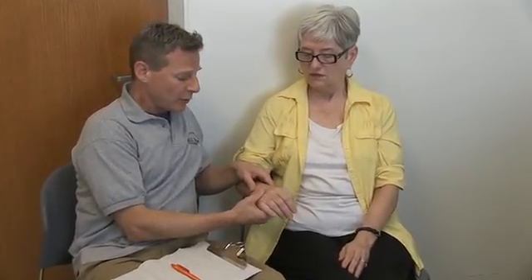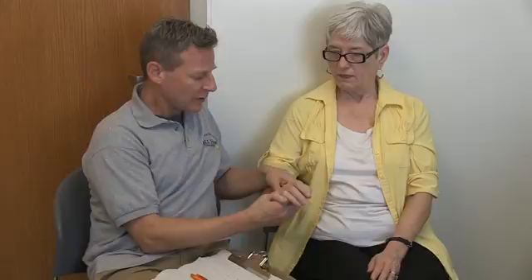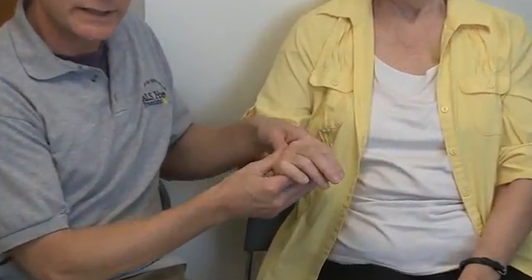Something else that Linda has brought to my attention is that she has some wrist weakness. So appropriate splinting today would include wrist support as well. Try to hold your wrist though. So we'll support her wrist in the splint today.